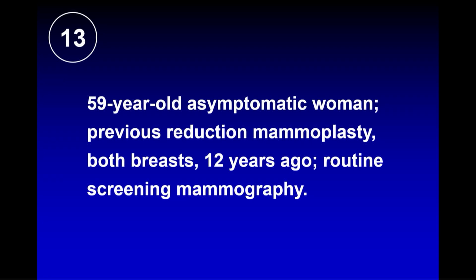That's one of the reasons why they want to get rid of the term developing, because nobody's been able to think of a term. Developing is kind of vague, but nobody's been able to think of a term that couldn't be suggestive to a plaintiff lawyer that something was there before. So if you just call it a focal asymmetry and you don't say that it's changed, then they can't go back at you. That's part of the rationale.